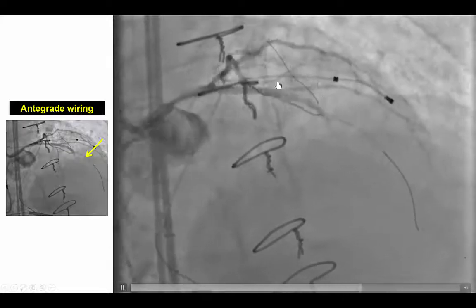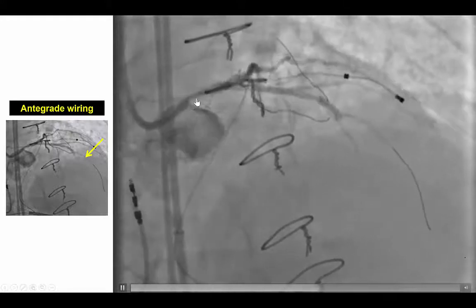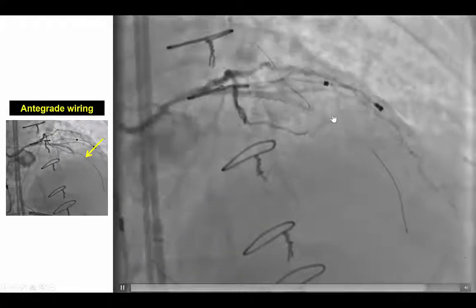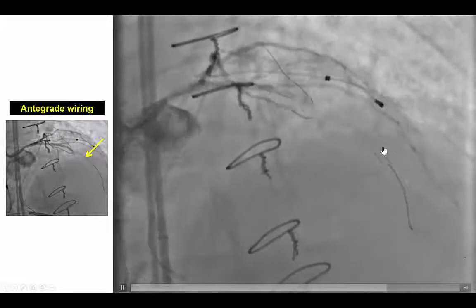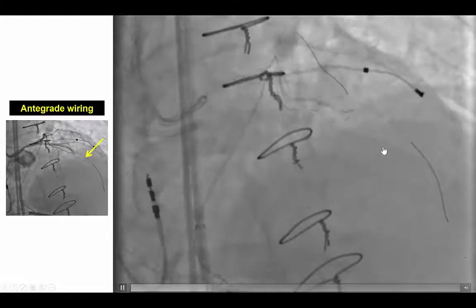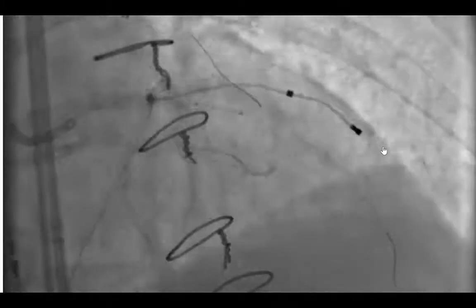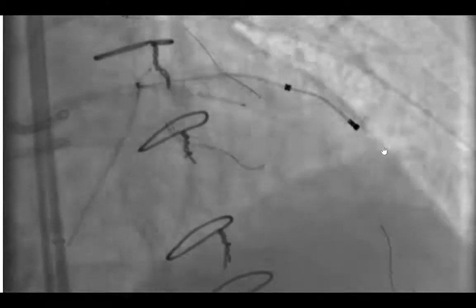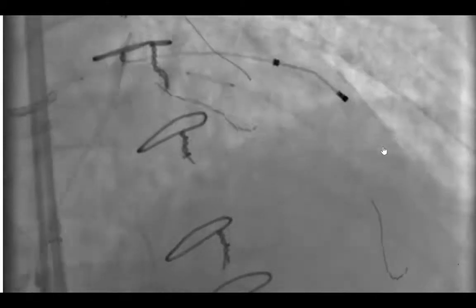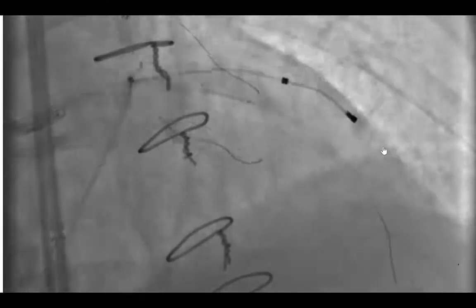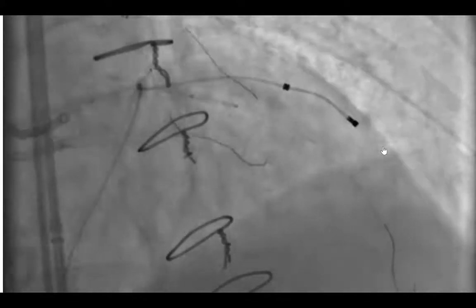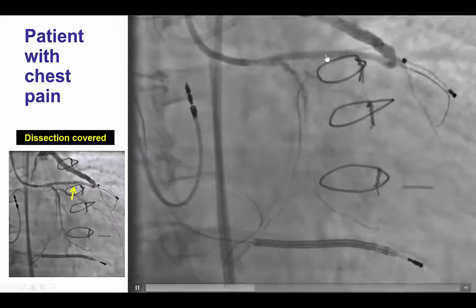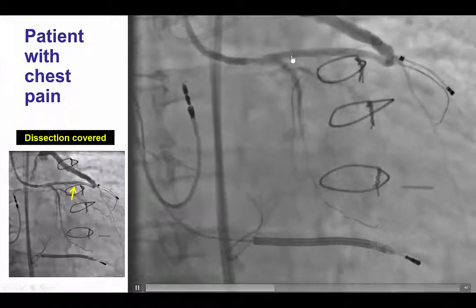We were able to advance a soft workhorse guidewire through the mid LAD into the second diagonal branch. We then proceeded with stenting of the proximal and mid LAD after removing the retrograde equipment, and that restored antegrade flow in the LAD.